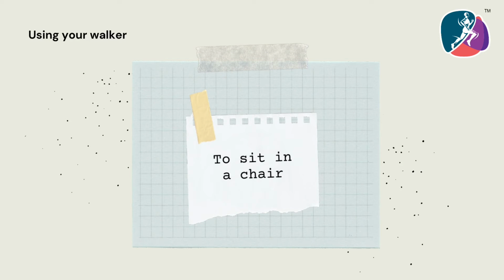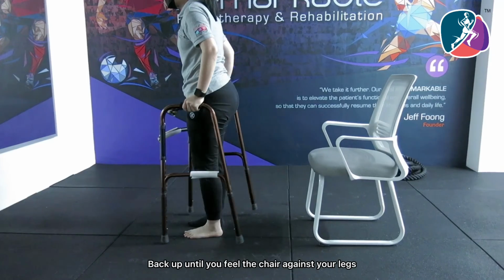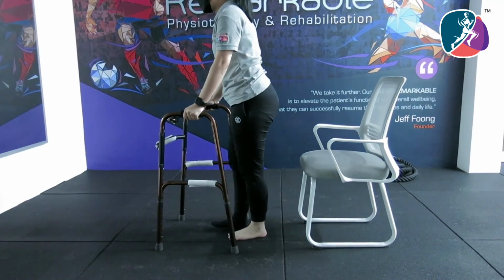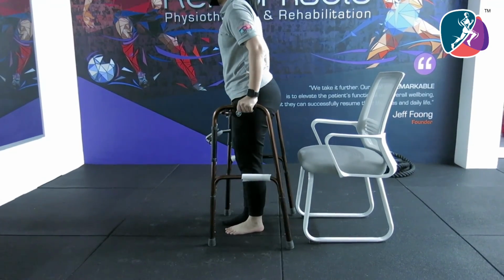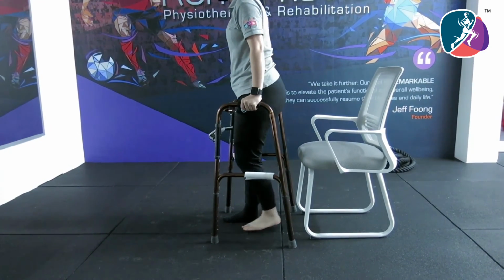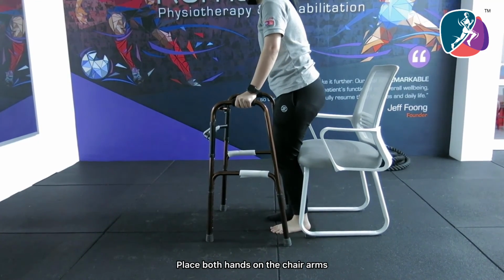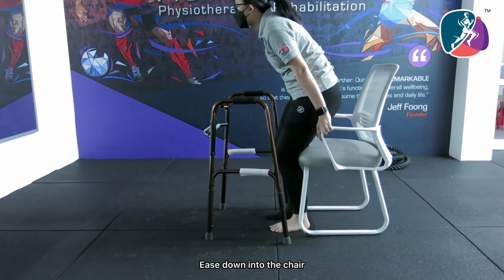To sit in a chair, back up until you feel the chair against your legs. Place both hands on the chair arms. Ease down into the chair.